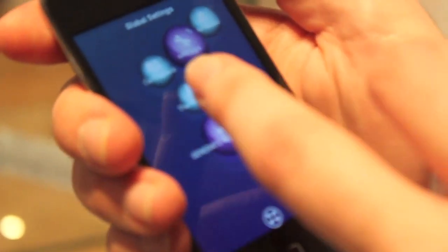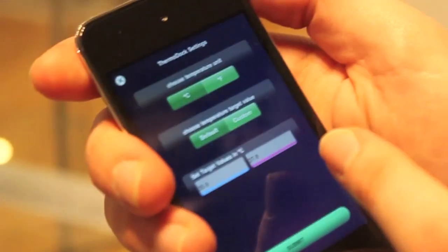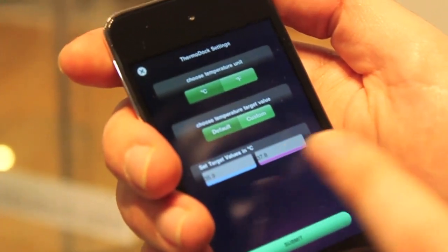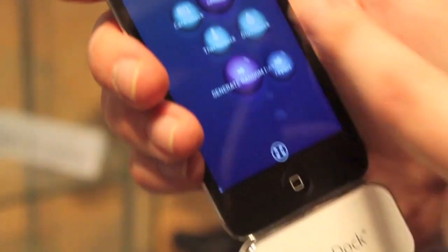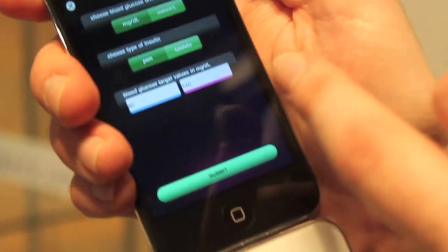In my settings, I can set the range for temperature — body temperature. And here I can also set this as my blood sugar range.